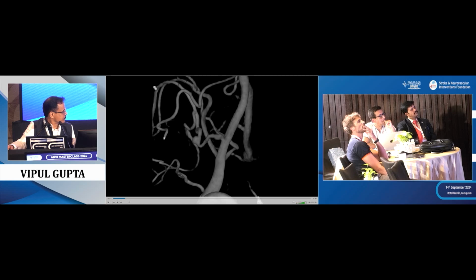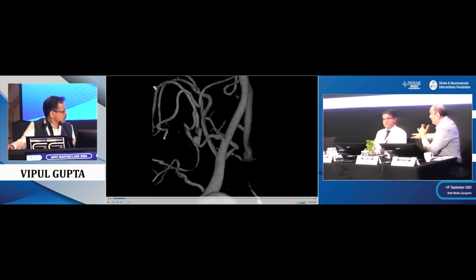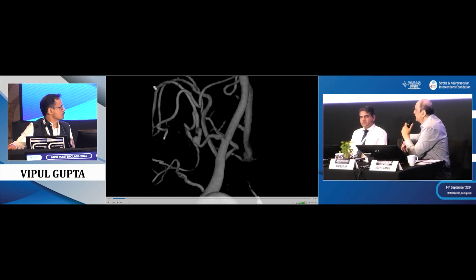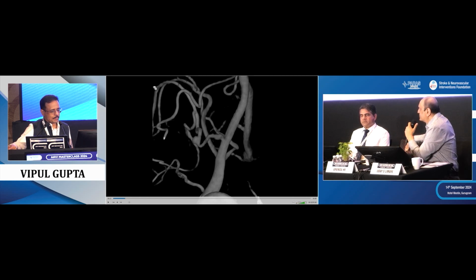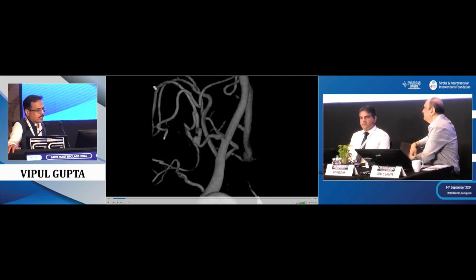So as always, you know our opinion. As always, reconstructive, or maintaining patency of the artery, is supposedly safer. Supposedly no one wants to occlude. But a deconstructive technique is not just sexy, it is actually very effective. And distal PICAs, on the surface of the cerebellum, will have collaterals from the SCA. Of course.